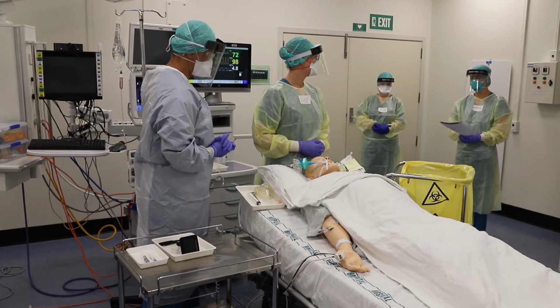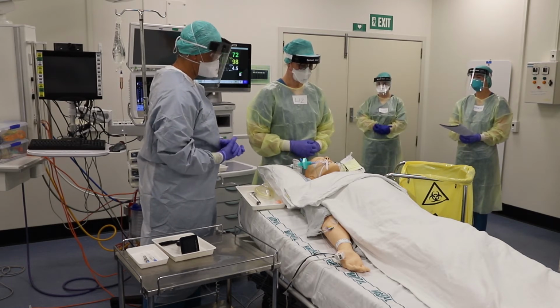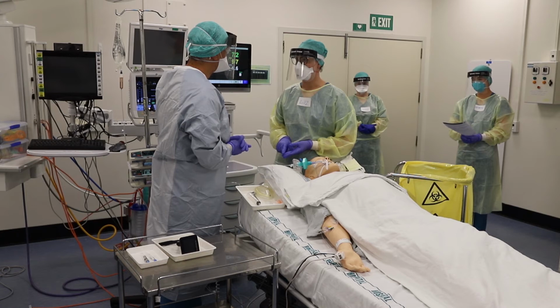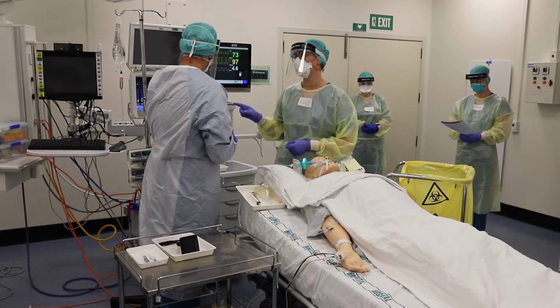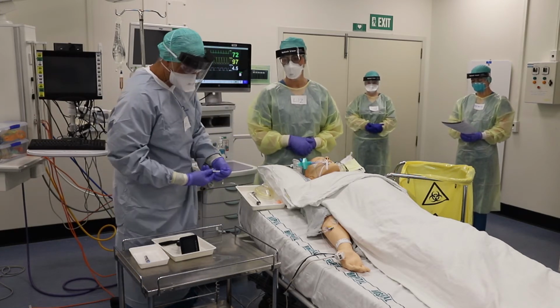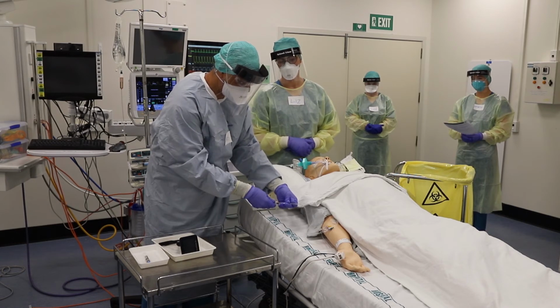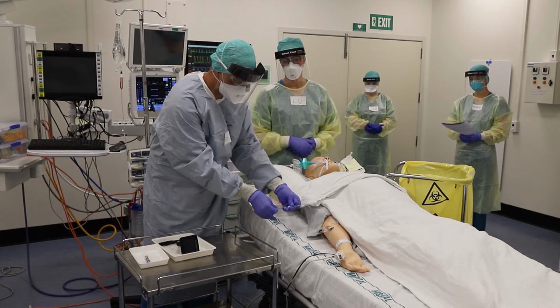Turn off anaesthetic, reverse paralysis, and plan for smooth emergence. Okay, so could you please give 2 mils of sugammadex, 5 mils of lignocaine, and turn the sevoflurane off, and I'll get you to put it on 100% at 10 litres a minute. Sure. So sugammadex going in. So connect to the patient. Injecting 2 mils. 2 mils in, doctor.